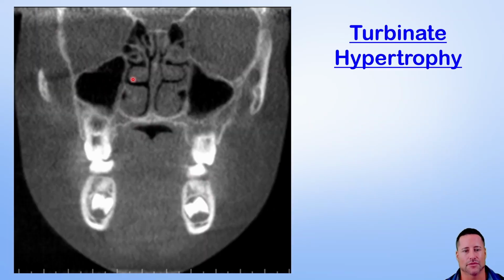Here's another example of turbinate hypertrophy. You can see those turbinates. Again, when we go by the simplistic approach of if there's not black, you can't have air go through, that is really easy to see. Also notice that sort of little heart-shaped tongue there. That's because the tongue is squished in. And if you don't take a coronal slice like this, if you're just looking at a sagittal like in a Ceph, you can't appreciate what is happening at all.